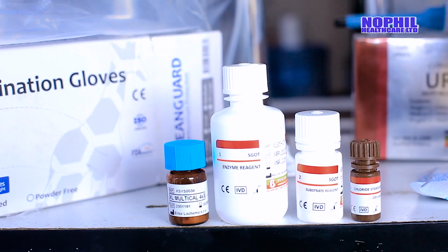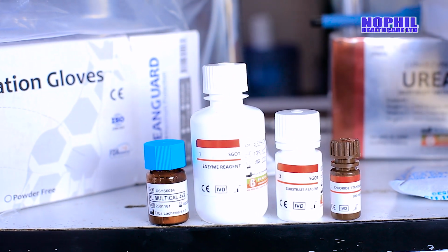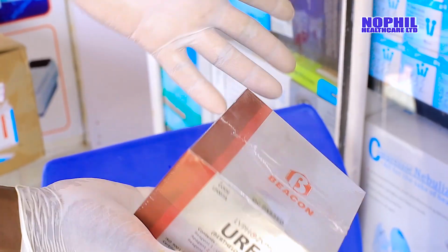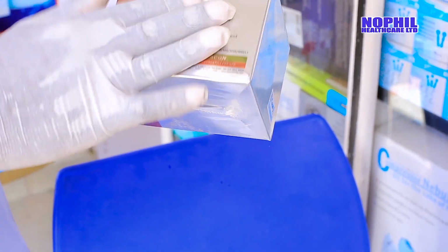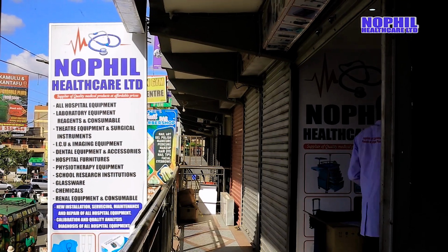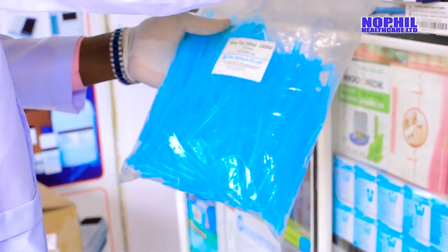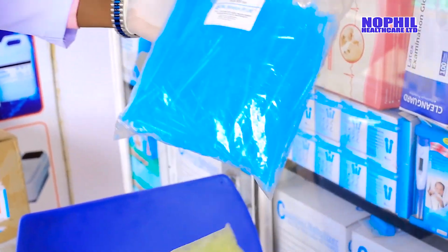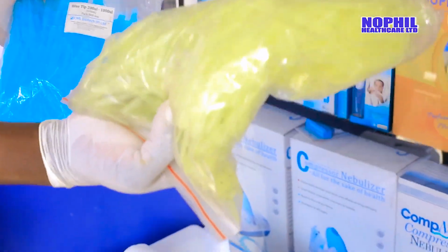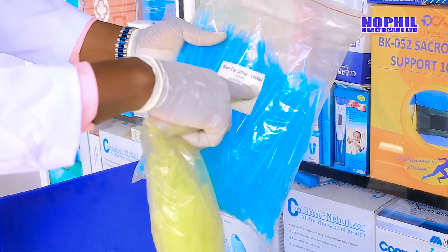They are ISO certified. They have undergone KEBS test, and they have very long expiry, as you can see. Here is a urea reagent, and the brand is Beacon. We sell them at affordable price, and they can help you to perform various tests. Another component that we are selling is micropipette tips. We have the yellow tip and the blue tip. The yellow tip is used to pick sample up to 200 micro, and this one up to 1000 micro. As you can see, it is well indicated.